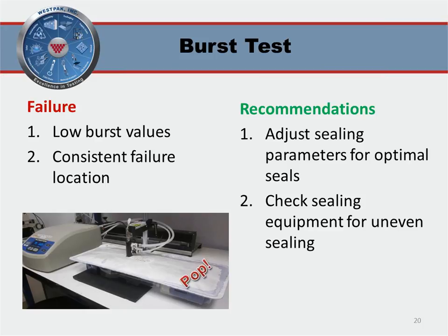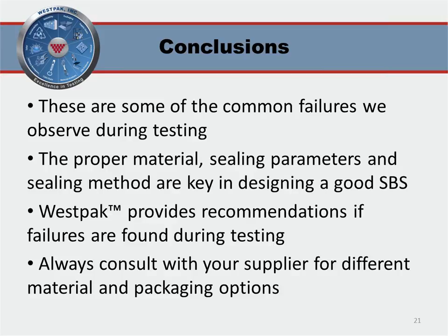All right, so some final thoughts. These are just some of the common failure types we see here at Westpak in regards to SBS testing. Again, we see our fair share of failures, and these are just some general recommendations for correcting these failures or preventing them in the first place. Hopefully a good starting point for you folks. After going through these different common failure types, it would seem apparent that the key to maintaining a good sterile barrier system is by using the proper material and design and using the correct sealing parameters and sealing method.